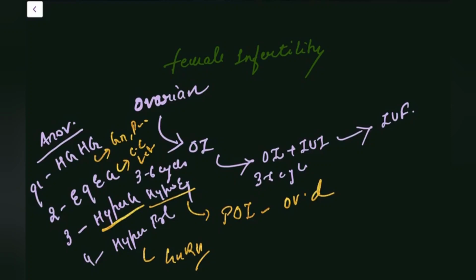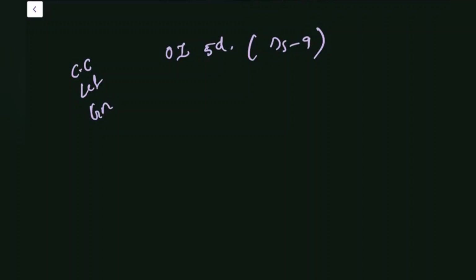So these drugs actually work by increasing the development of follicles. Let's say I have treated one patient of infertility with ovulation induction, giving ovulation inducing drugs like clomiphene citrate or letrozole, or injectables like gonadotropins for 5 days, from day 5 to day 9. And then we ask the patient to undergo regular follicle monitoring. The dominant follicle develops. Ideally, it achieves 18 to 20 or 20 to 25 mm size.